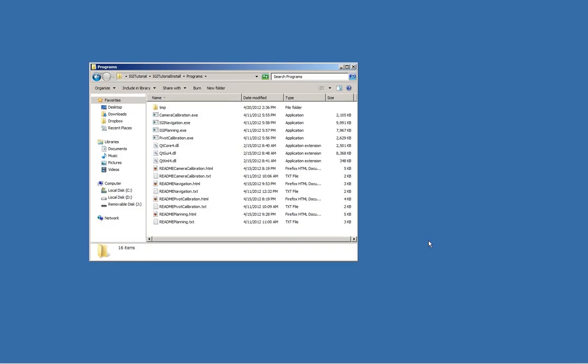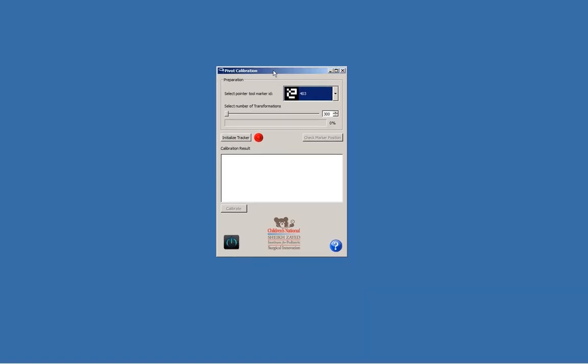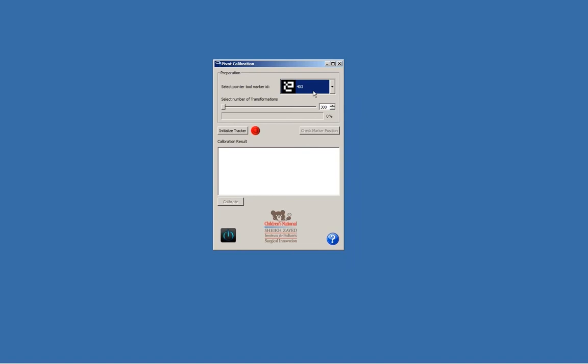We'd like to perform a pivot calibration and we'll go to the pivot calibration program. Remember that for this to work you have to run the camera calibration beforehand and calibrate your camera, otherwise this program will give you an error indicating that you haven't done so. The first thing is you need to select which marker tool to use.